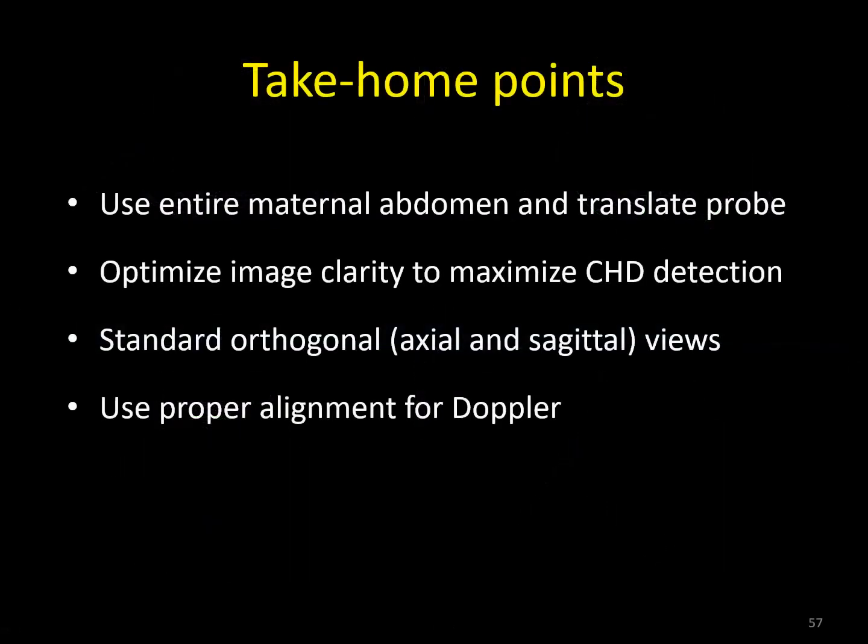So some take-home points for the presentation. You want to make sure, again, that you use the entire maternal abdomen and translate the transducer to get the angles that you need. Again, don't just stay in one spot. If you see the views that you like, you may find a better angle in a different part of the maternal abdomen. Also with mobile fetuses that are moving actively, you may need to do this.